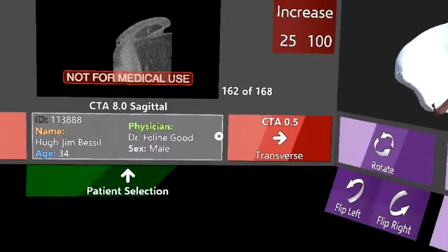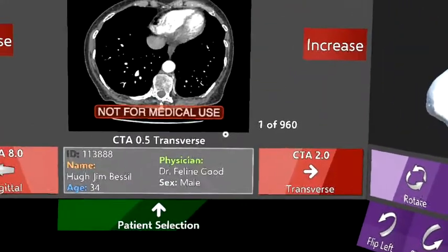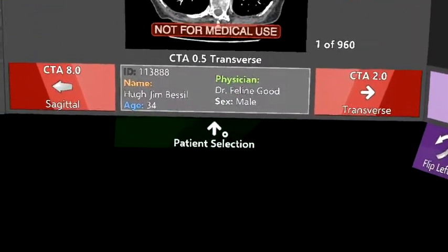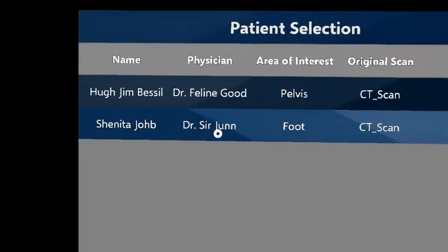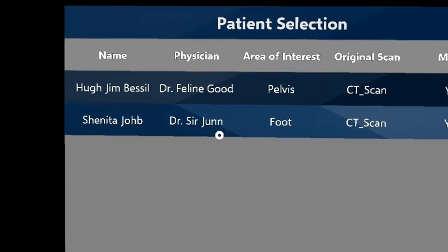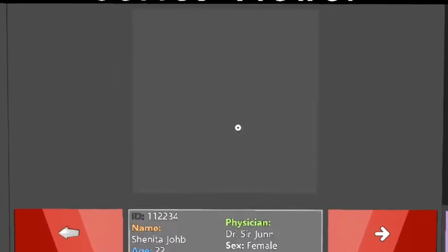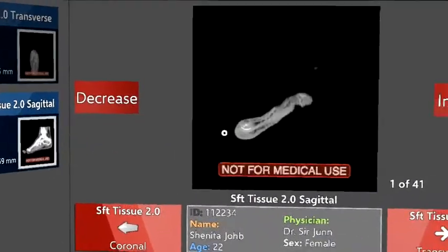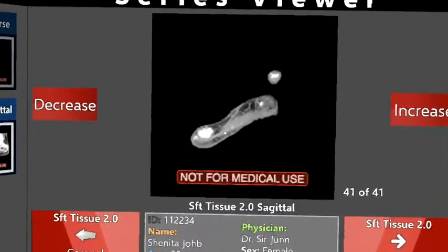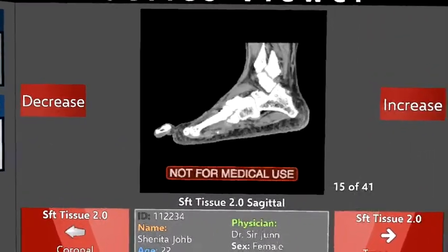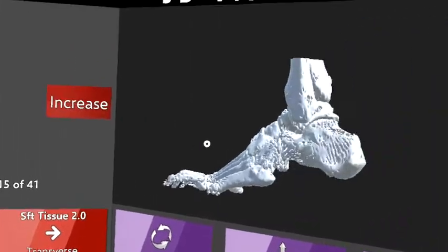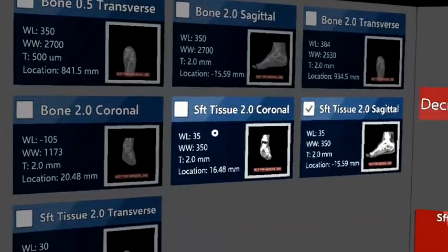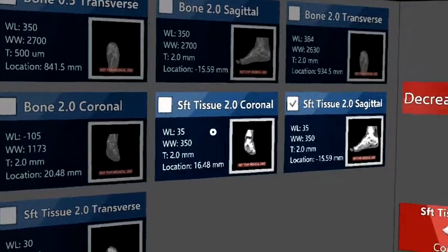I can also look at the transverse view — I can switch views within this area. Or I can switch patients. I can switch back to the foot now. These are all the patients that I have rights to today. And again I can go through the foot and look at the different views. In this case there are actually seven different views of the foot.